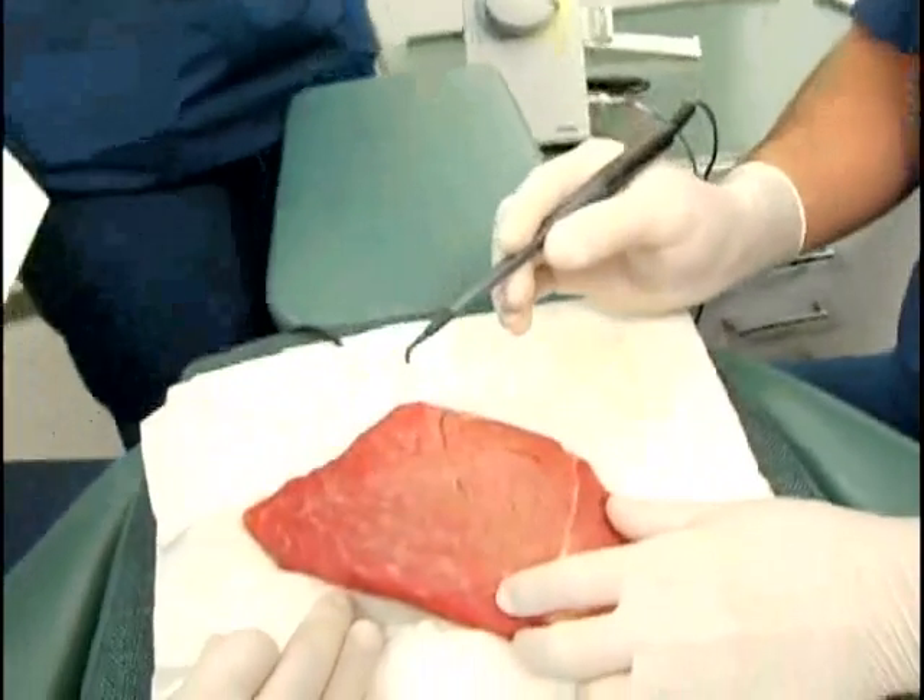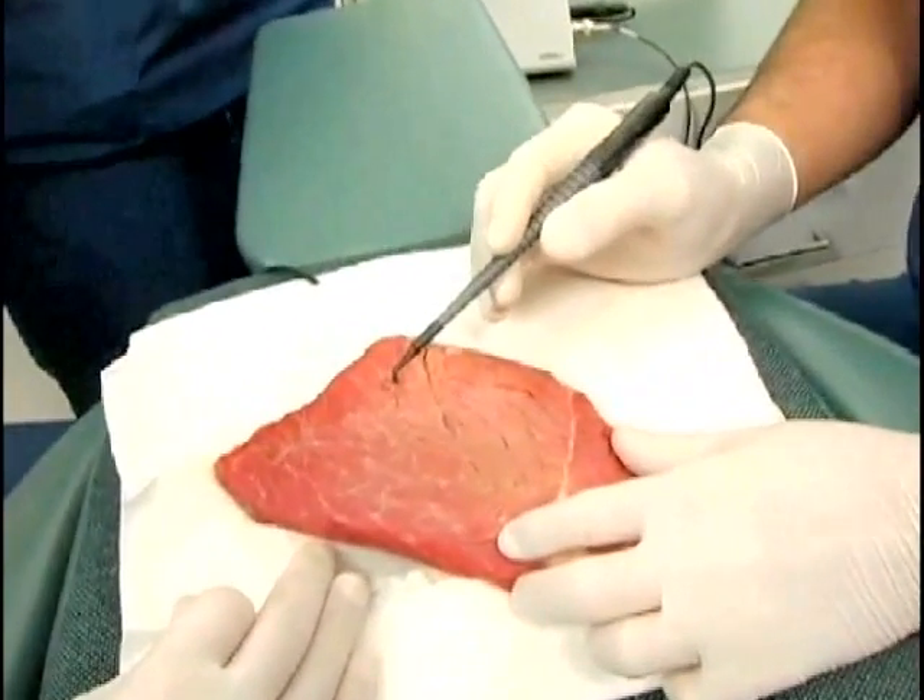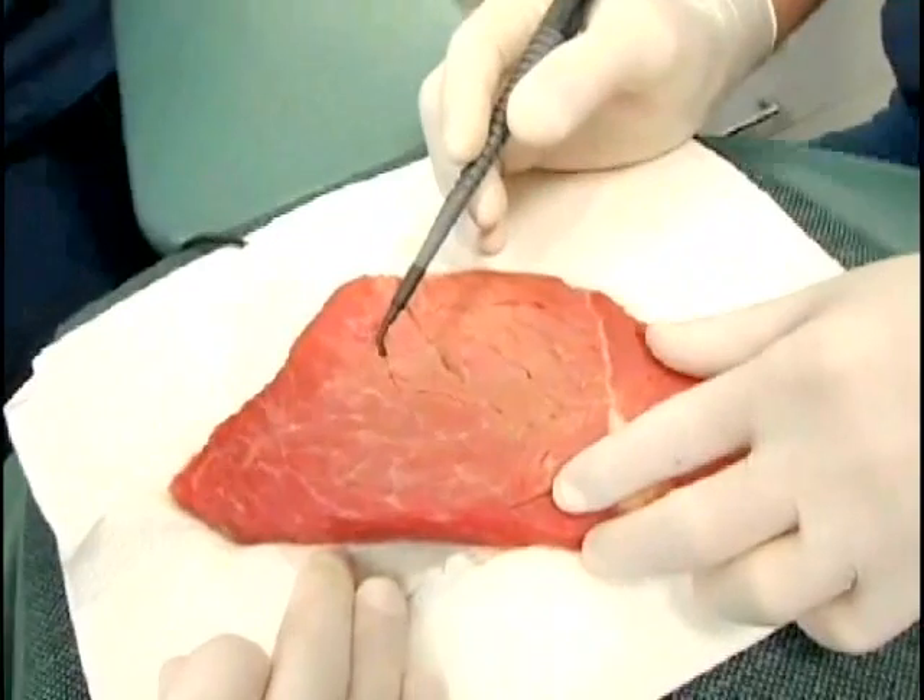Now we are going to use the long loop electrode. This technique is ideal for gingival contouring or removing excess tissue.